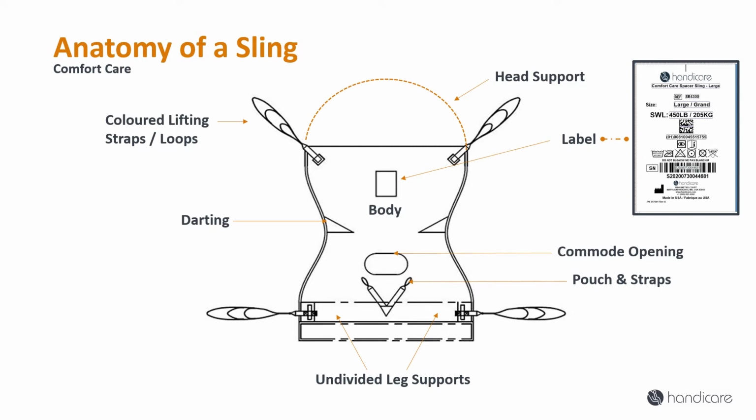There may be other situations where a leave-in-place sling is considered. Keep in mind the decision to leave a sling in place requires a thorough assessment by a healthcare professional and sound clinical judgment. Once a decision is made to leave a sling in place, continued monitoring of the resident's skin integrity and maintaining a positioning schedule that meets the resident's needs is still required.